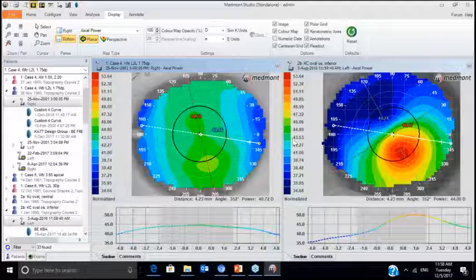But here we have a patient that also shows only 1 1/4 diopters of corneal astigmatism. Yet would this be a straightforward case where we could predict the parameters of the lens based on K readings? The answer would be no. It would be so difficult. Yet both these corneas have 1 1/4 diopters of corneal astigmatism, because K readings have to take an average of this point and this point and this point and this point. So it's going to be limited in its ability.